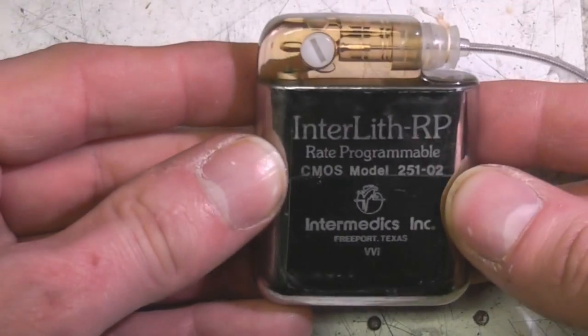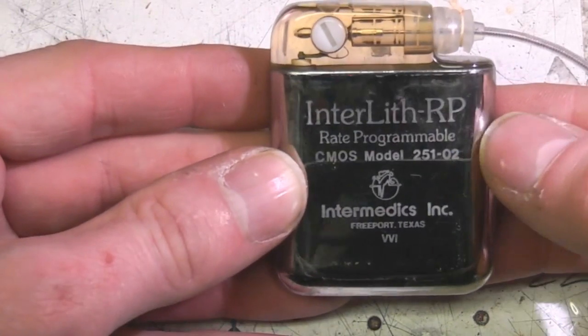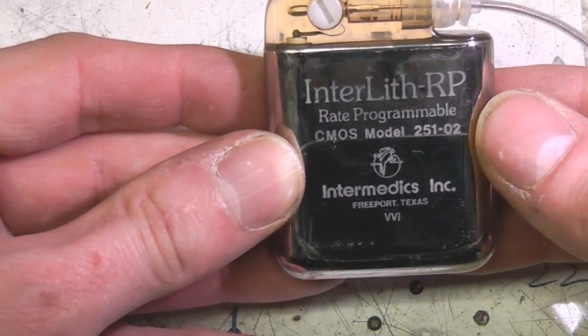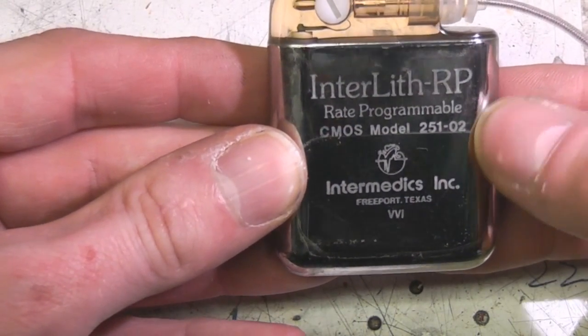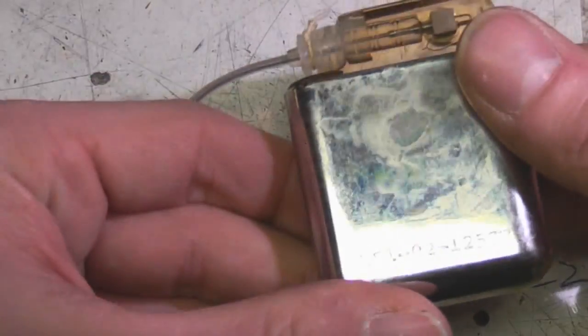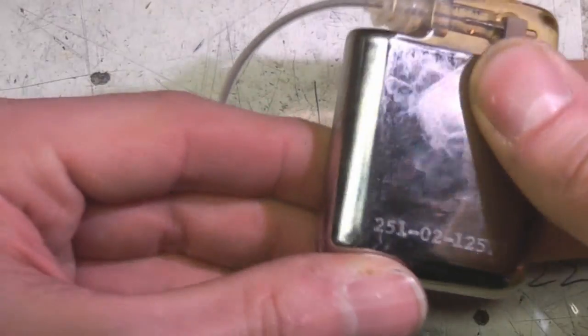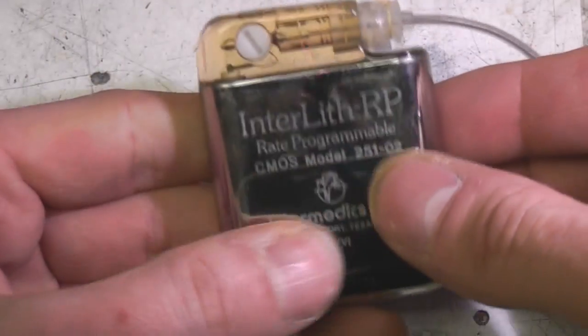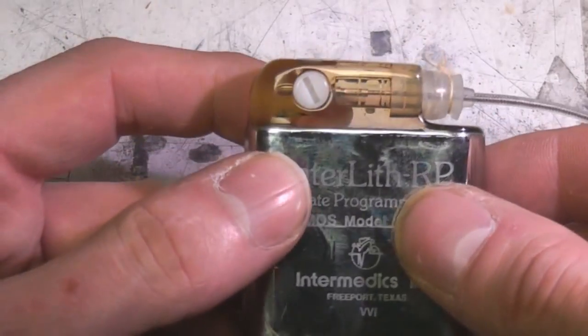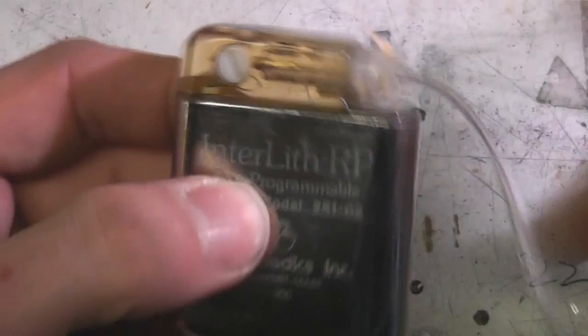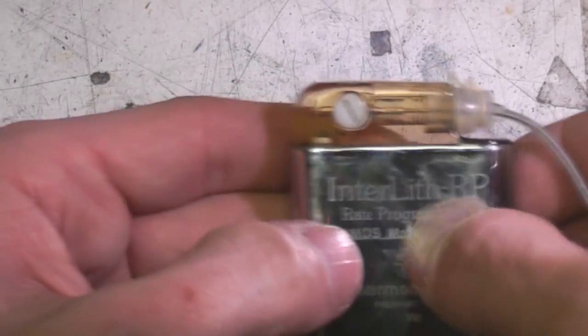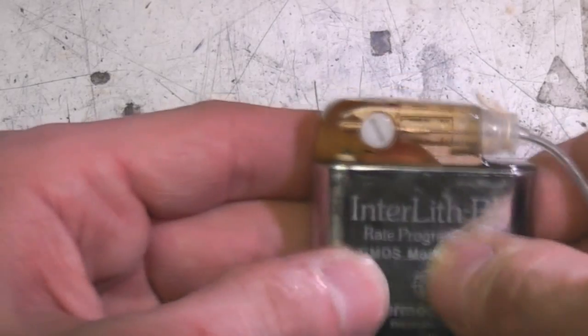Today we've got another implantable medical device courtesy of eBay. This is an Interlith RP rate programmable CMOS model 251. I think this is a fairly simple pacemaker rather than the defibrillator we saw last time. It's fairly clean, so either it hasn't been implanted or it's been thoroughly cleaned, or possibly it's a demonstration model. Although I thought if it was a demo unit it would have a big label saying this thing doesn't work, please don't implant it.